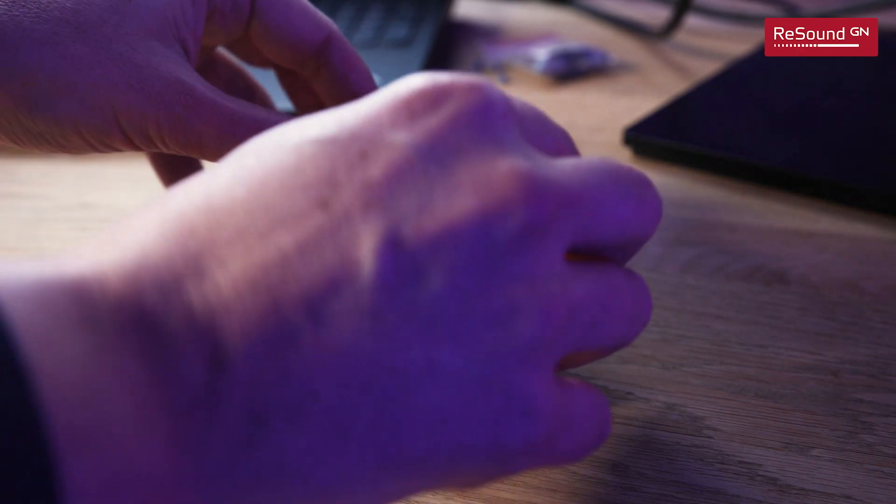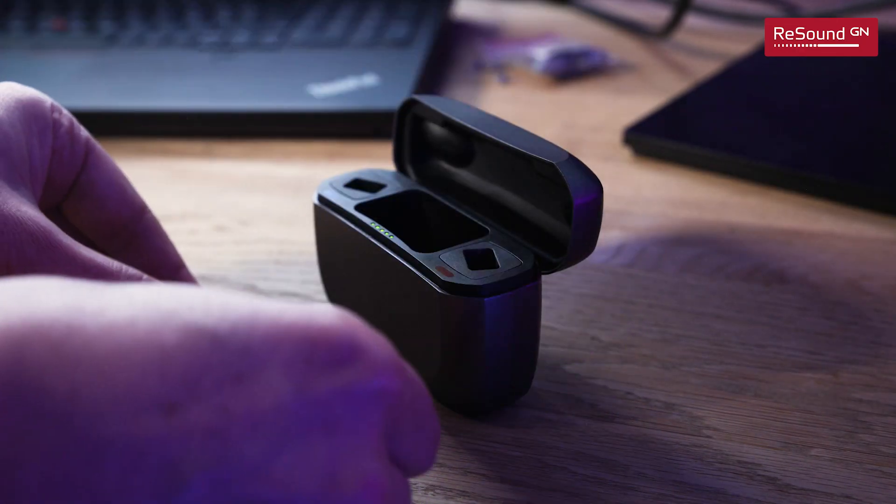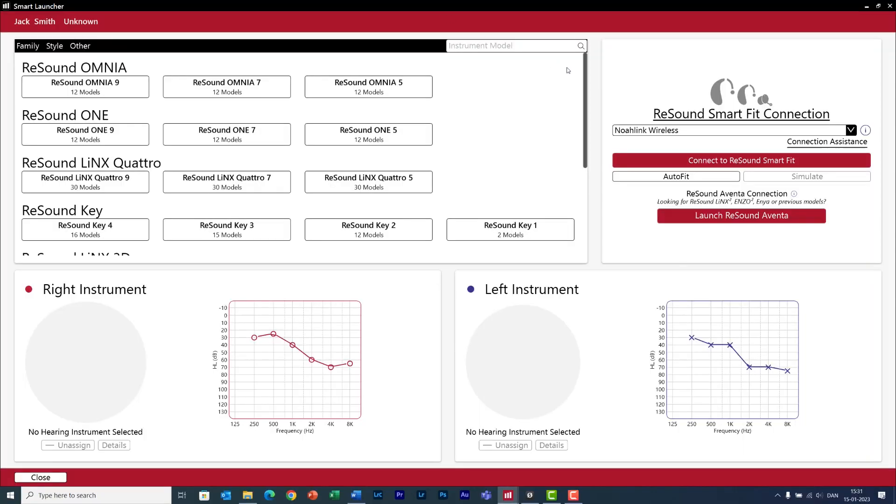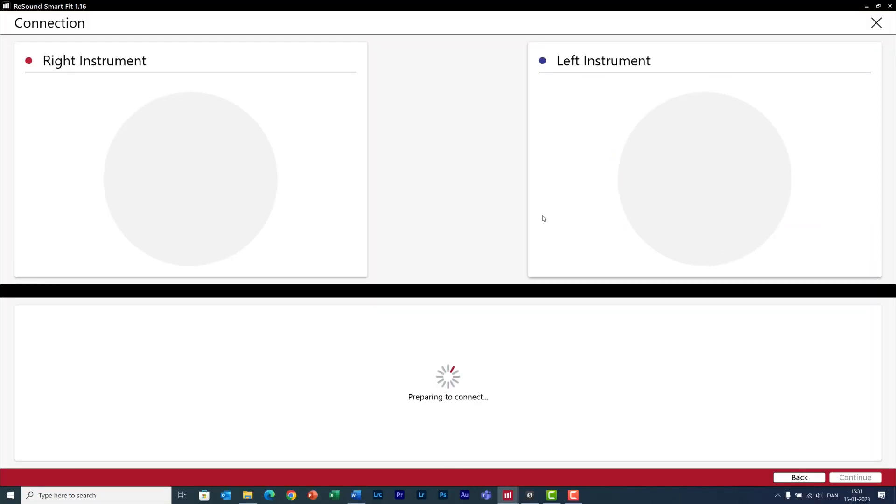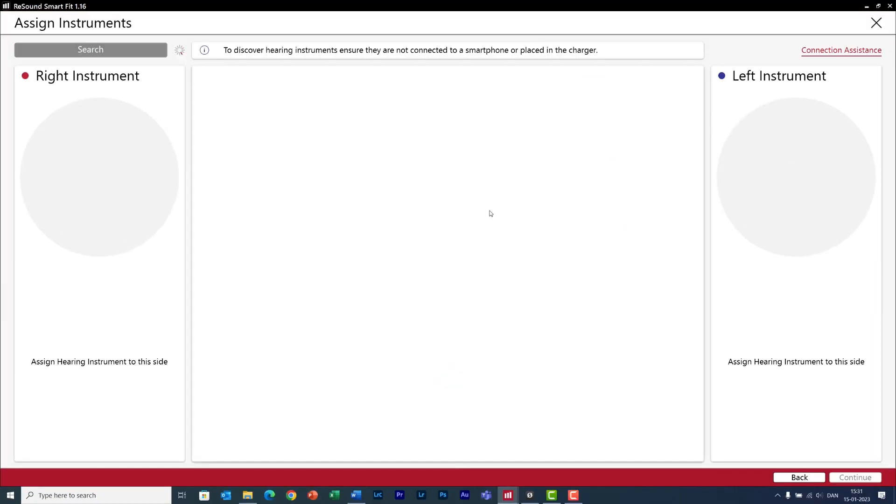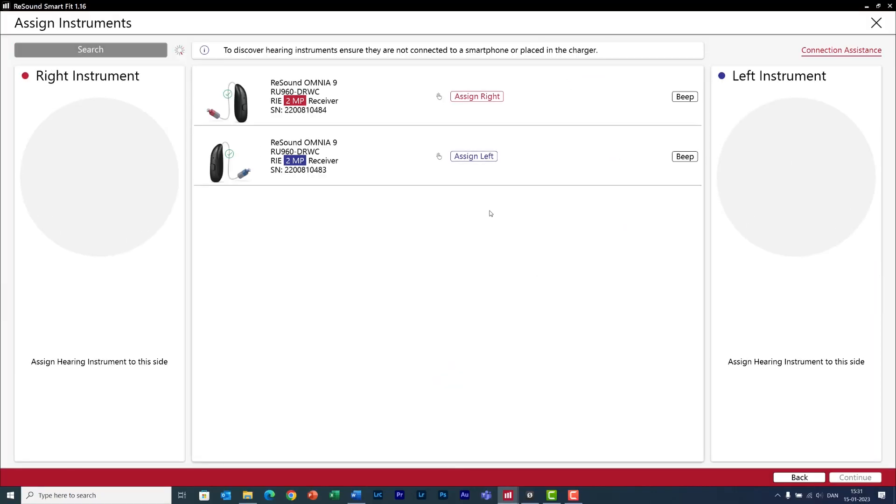One of the first things the hearing aids do is to look around for friends who want to connect with them and they will do that for two minutes. I take the hearing aids out of the charger, click, connect, and here they are. This is like searching for wifi.